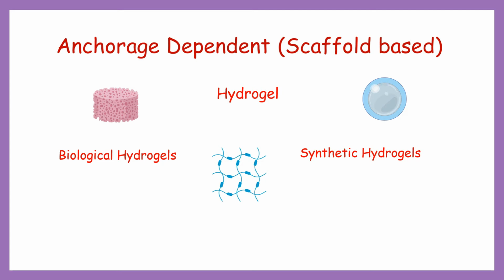Hydrogels from natural sources such as collagen and Matrigel are biocompatible, have natural adhesive properties, and sustain many physiological cell functions, resulting in high cell viability, controlled proliferation, or controlled differentiation, and often a cell phenotype typically observed in vivo.